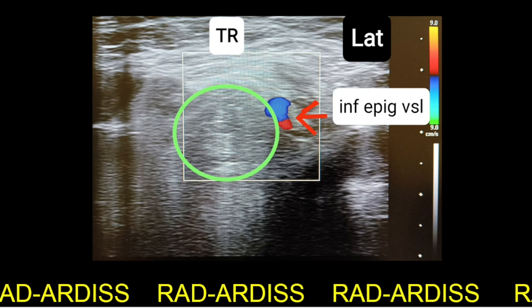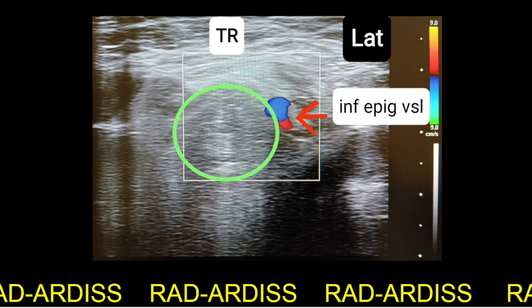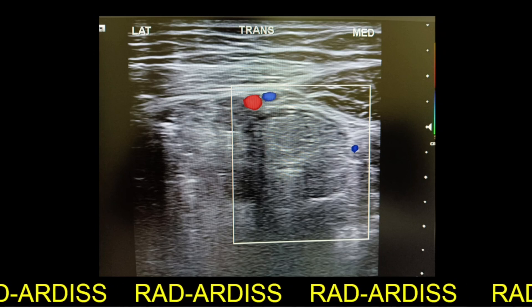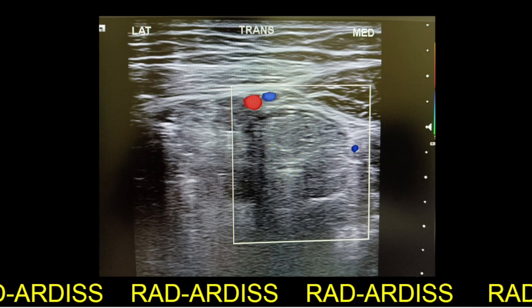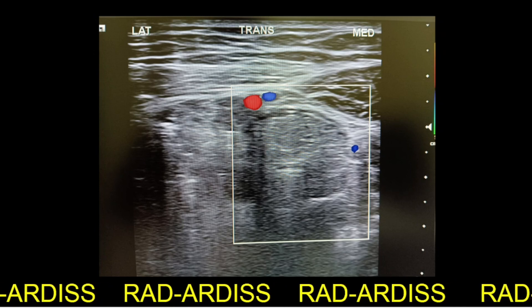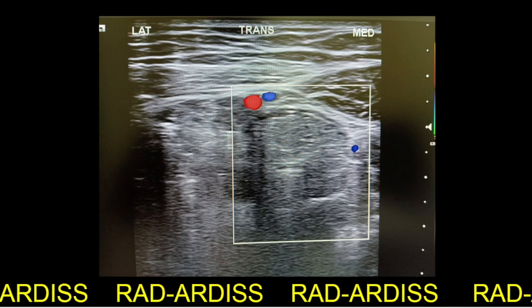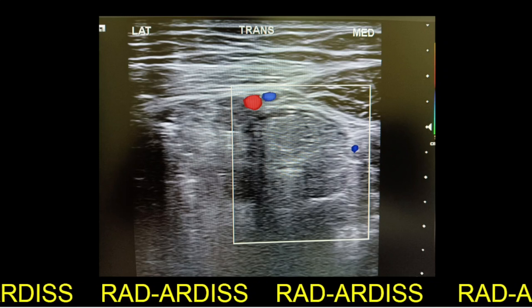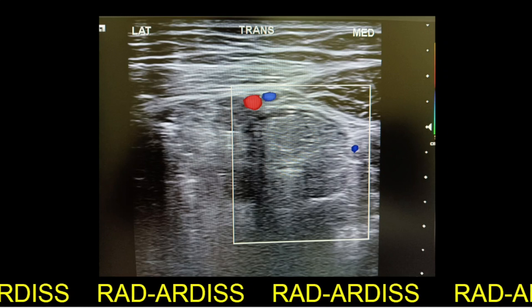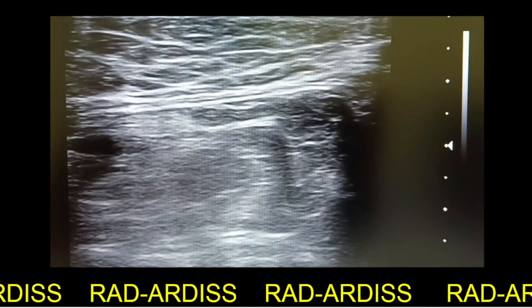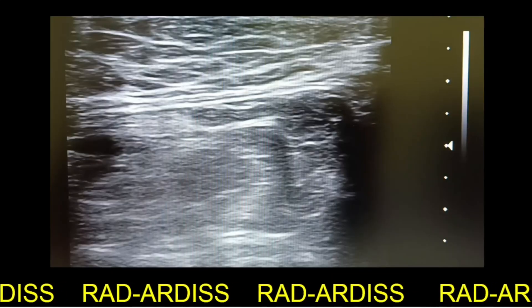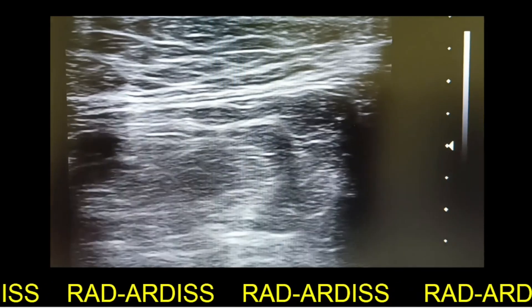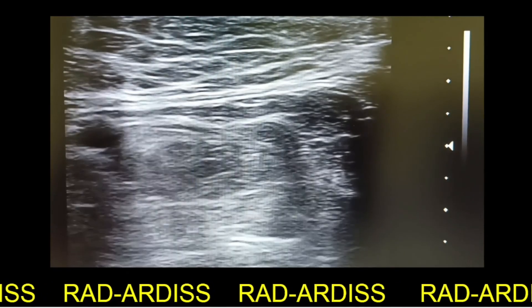This is the annotated image of the previous slide. This is another similar case where a swelling is seen feromedial to the inferior epigastric vessels, and on increasing the intra-abdominal pressure, the intra-abdominal contents herniate into the sac.